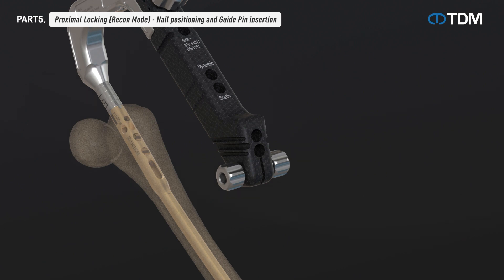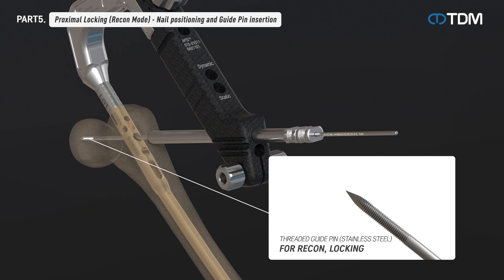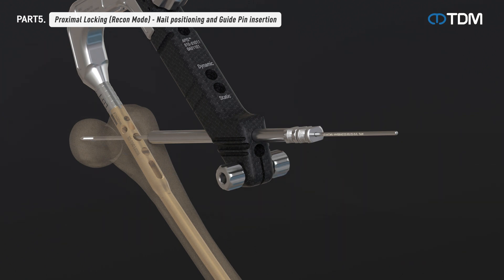Check the nail position and insert the sleeve combination into the target device hole. After removing the trocar and inserting the guide pin, use radiographs to confirm that the guide pin position is 10 millimeters away from the end of the femoral head. Insert two guide pins in the same way.